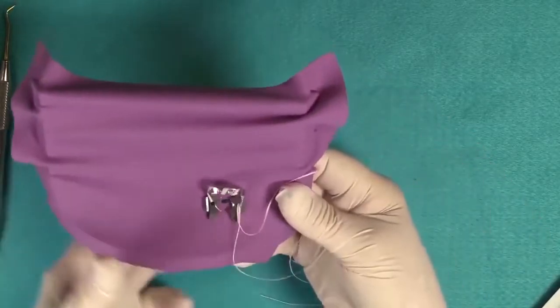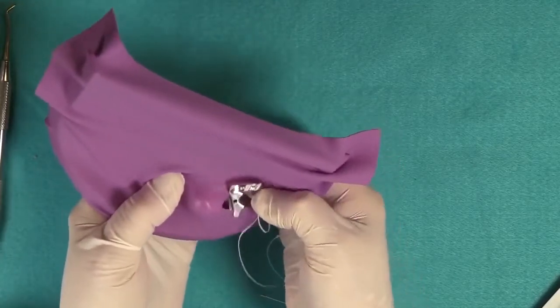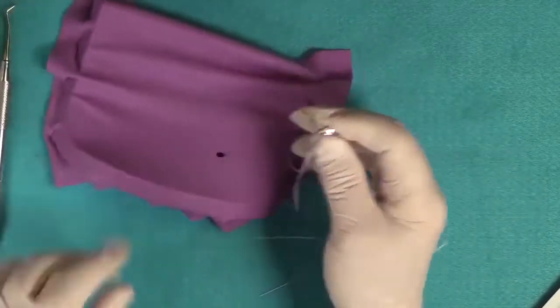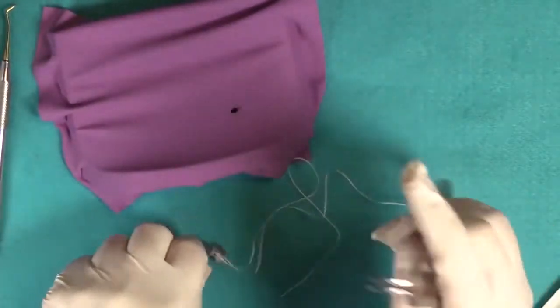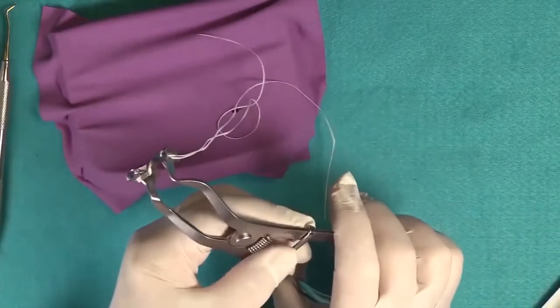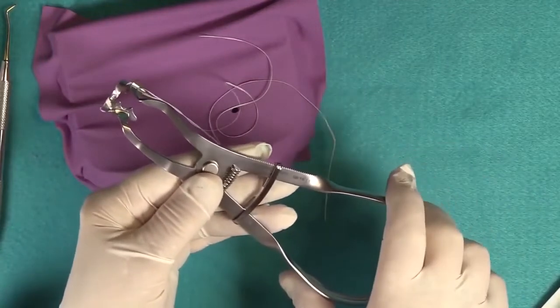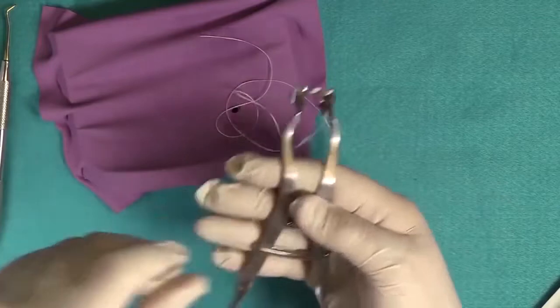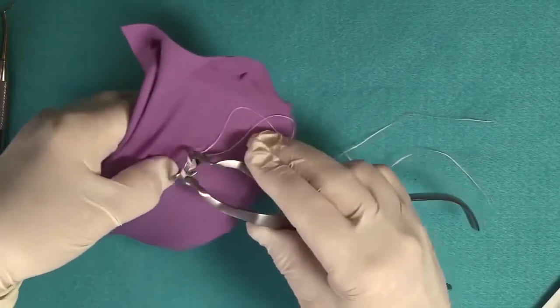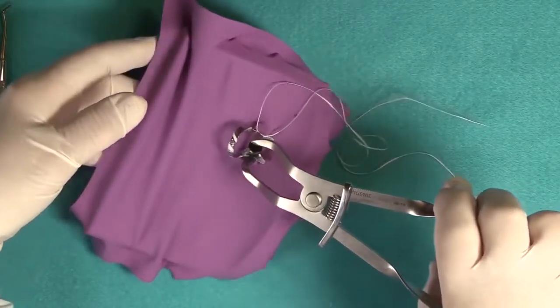You could do it with your fingers, laying the clamp parallel to the dam, and just stretch the wings so that they're underneath, as such. Or, if you want, you can insert the clamp into the forceps, lock it so it's in a locked position. Now when it's locked, don't put pressure on the handles, it'll unlock your device. So you can handle it anywhere except the handles. And you can just simply lay it in like this. And then when you go to the mouth, you're going to put this in an unlocked position.